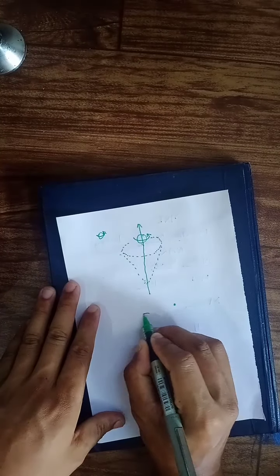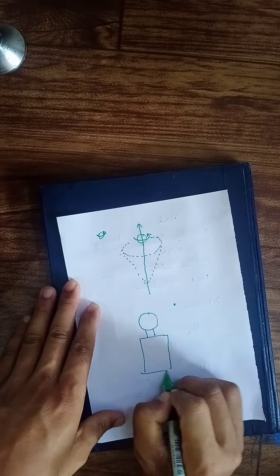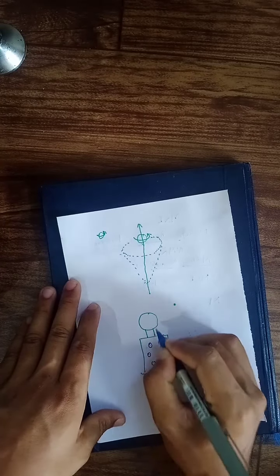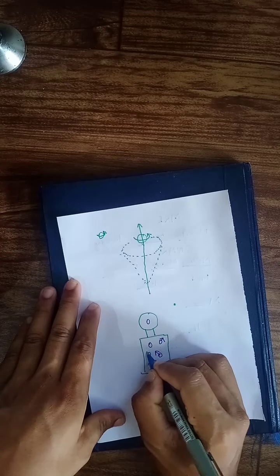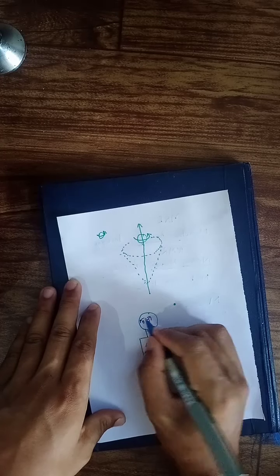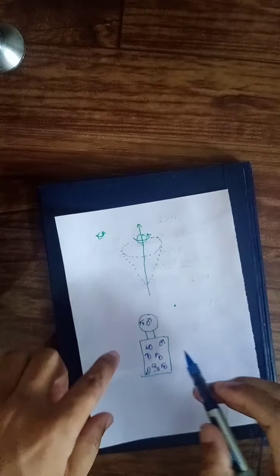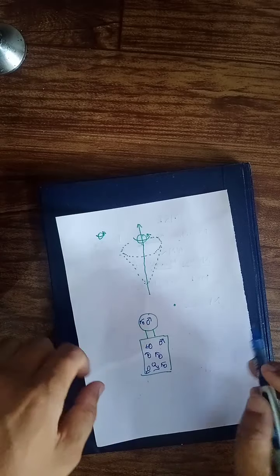Suppose this is a human body. Let me use another pen to show you the proton. Suppose this is your proton. Proton is present everywhere inside your body. Suppose this is the head. Hydrogen protons you will find everywhere inside your body. But see the direction, it is in a random motion. It's not that I'm drawing it randomly. There is a purpose about this which I'll be discussing.